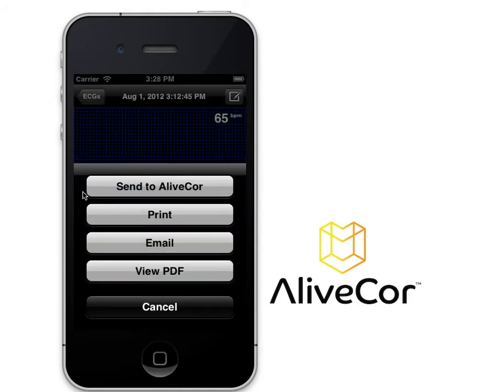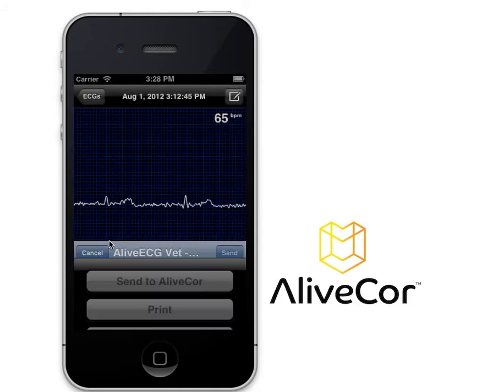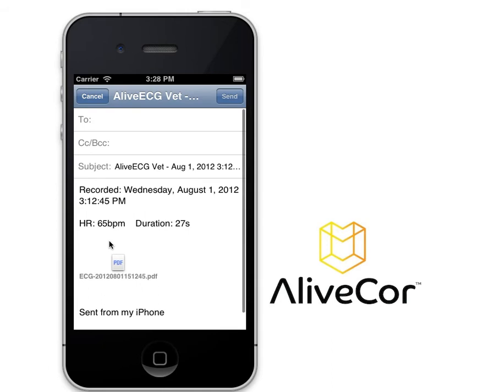To email the data, tap Email. The ECG data will appear as a PDF attachment in the email. All you need to do is address the recipient and press Send.